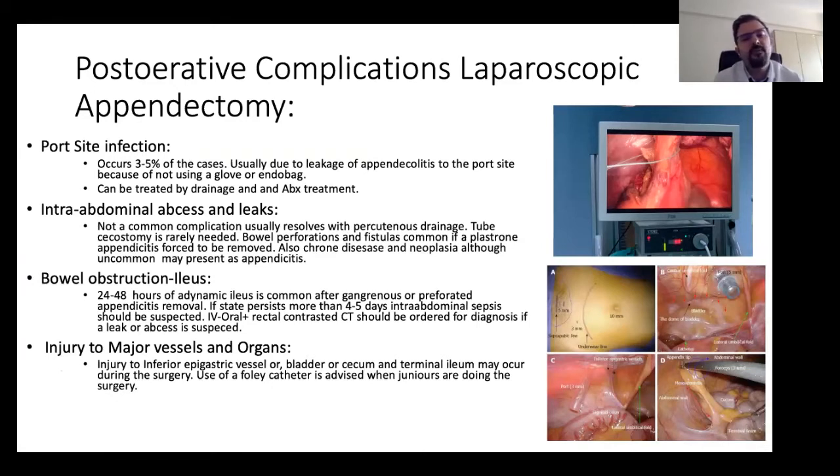What the juniors are doing is the laparoscopic appendectomy. It's a very simple, good procedure because you can see the whole abdomen by visualizing. But there can be some adverse events like port infections, especially in countries where the laparoscopic equipment is used more than once. It can be due to the appendicitis that leaked into the port site because no glove or endobag has been used. But it can be treated by simple drainage and antibiotics most of the time.